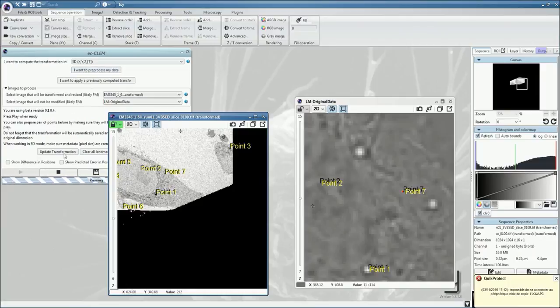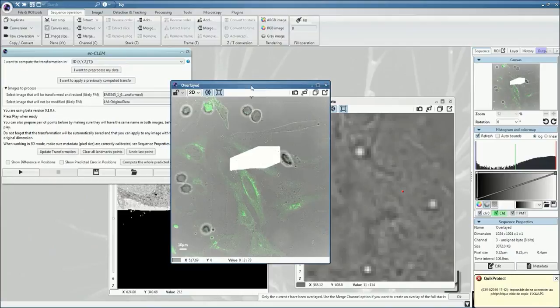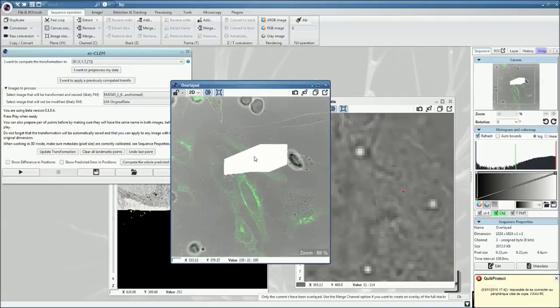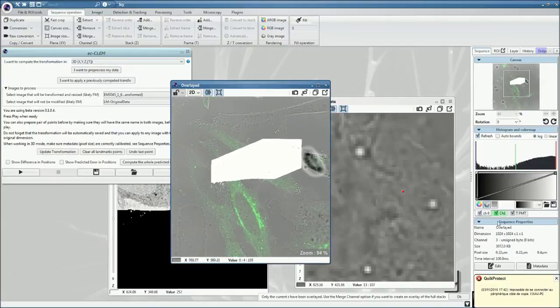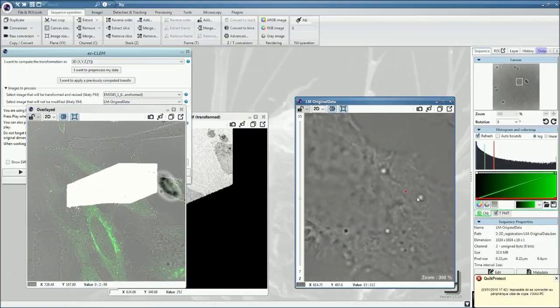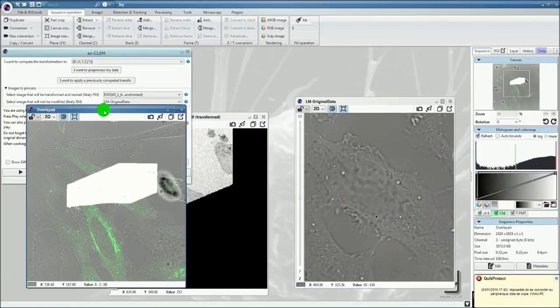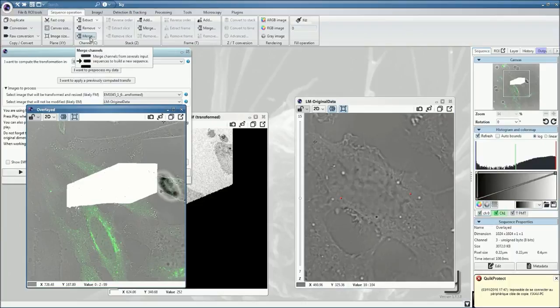Once all the points are placed, we can stop the plugin, and it will create a preliminary overlay of the two images. This is again a single-plane overlay corresponding to the plane of imaging here.